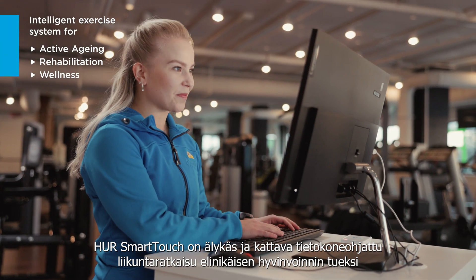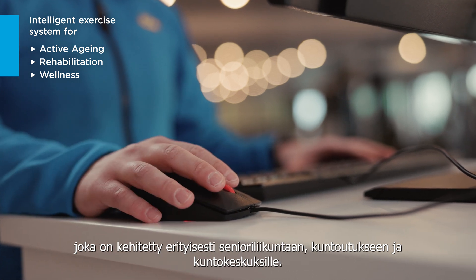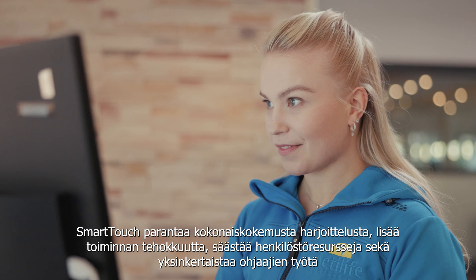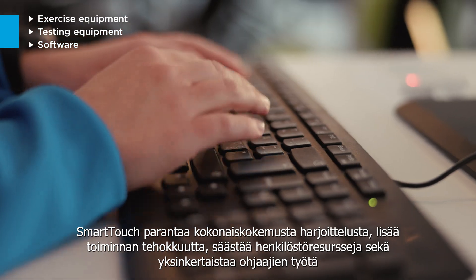HUR SmartTouch is an intelligent exercise system specially developed for adult and senior exercise, rehabilitation and inclusive wellness. It is the perfect evidence-based training and operating solution with both exercise equipment and software for clinics and wellness centers.